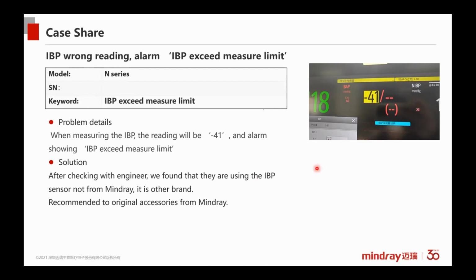Our Mindray patient monitor works with our original accessory. Because of the communication protocol, a compatible accessory from another company can sometimes cause problems. So we recommend using the original one from Mindray.